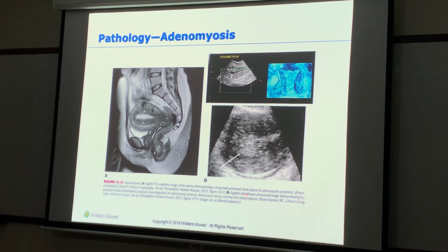it's a retroflexed uterus. Retroflexed. Anterior, posterior. If it's like this completely, this would be anterior and this would be posterior. Okay? If you can see the bladder and the whole uterus in the same plane, this is anterior, this is posterior. Because anterior stays anterior and posterior stays posterior.